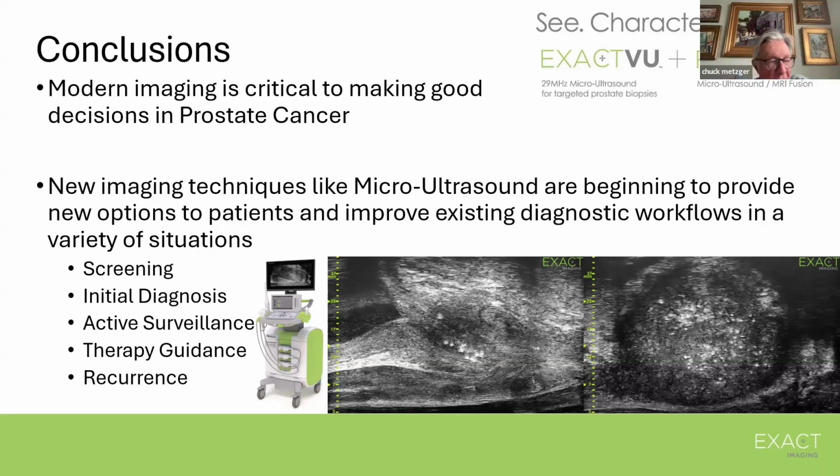And then how about approval from Medicare? So the system is currently reimbursed the same way as conventional ultrasound, which means that if a physician offers it, they can bill the same reimbursement codes as for a traditional ultrasound procedure. And ultrasound is already approved as medically necessary in the case of prostate cancer diagnosis. So everybody is not getting paid more than for conventional ultrasound, but still getting reimbursed for the technology already.